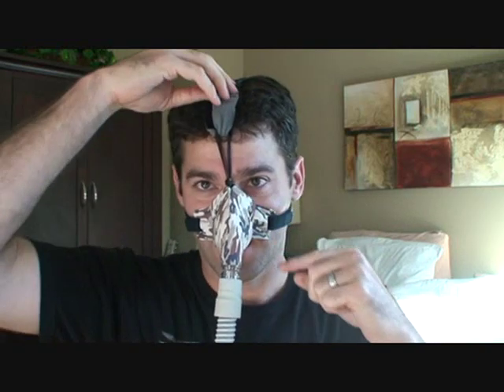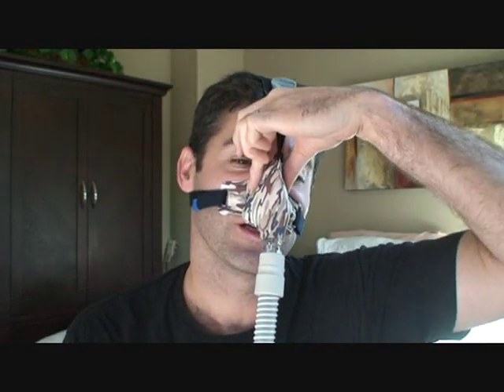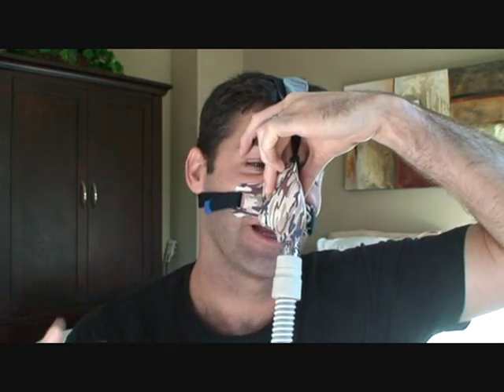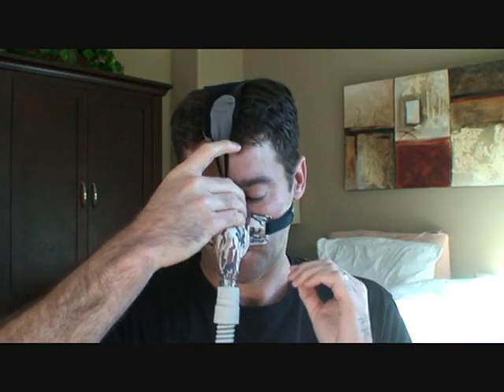There's a slight leaking right here. I found that when I pull this up, it seems to get rid of the leaks in here. And if not, when it gets to a higher pressure, that seems to help, as well as slightly pinching it here will take care of it. And then that gives the balloon time to inflate a little bit. It does need to be tight just a tad on the side. Perfect. I think that was about maybe a minute.